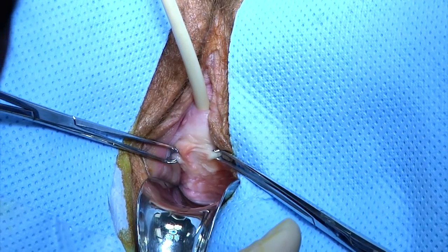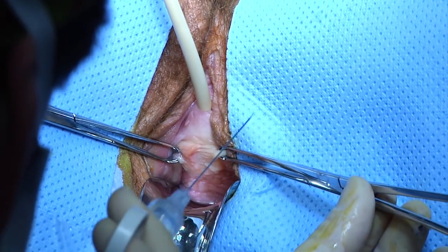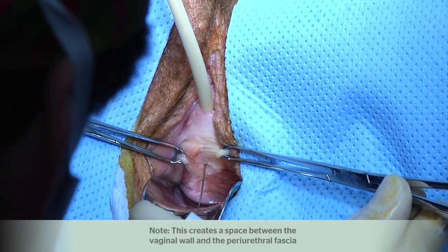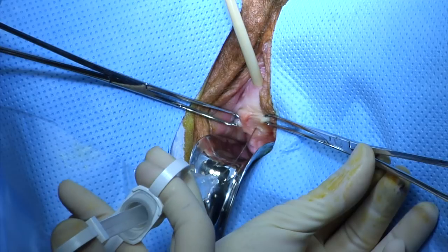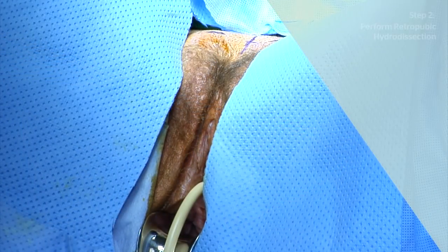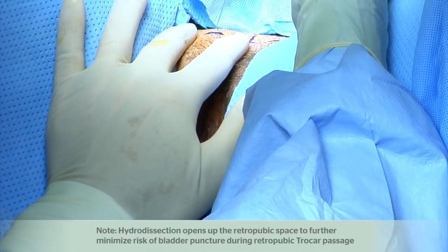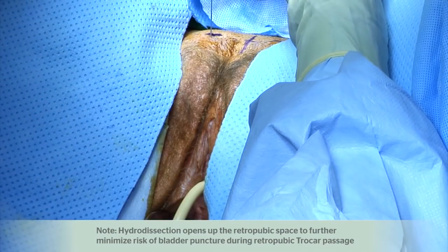At the level of the mid-urethra, inject local anesthesia submucosally. This creates a space between the vaginal wall and the periurethral fascia. Now perform a retropubic hydrodissection. This will open up the retropubic space and minimize the risk of bladder puncture during the passage of the trocars.